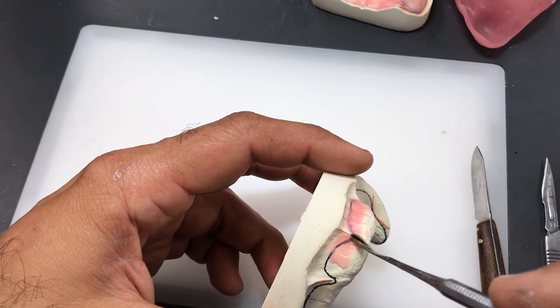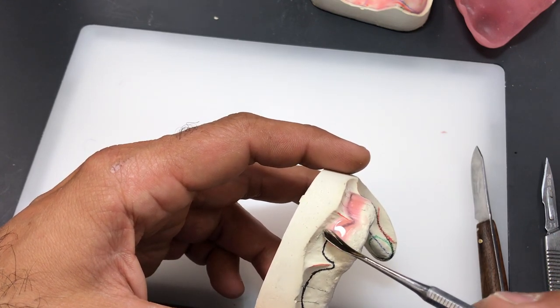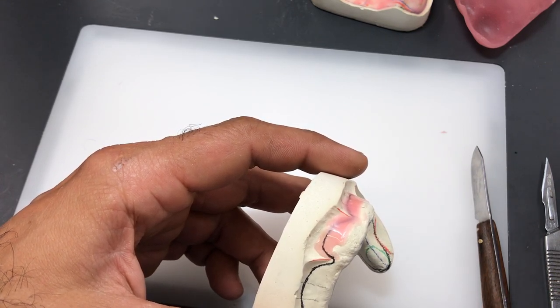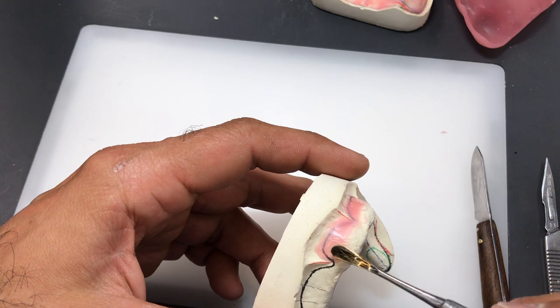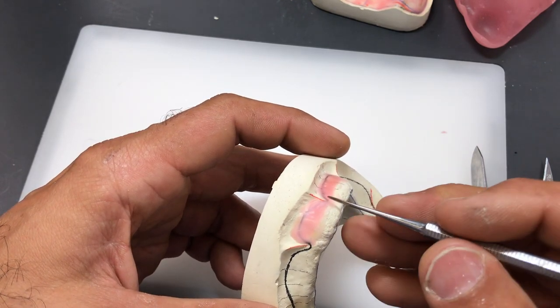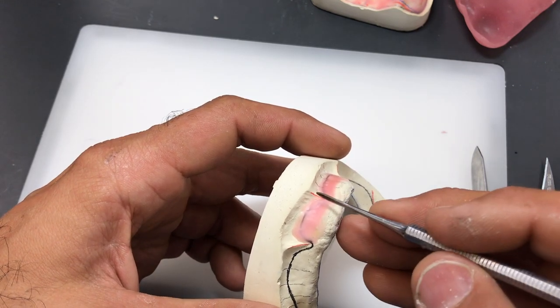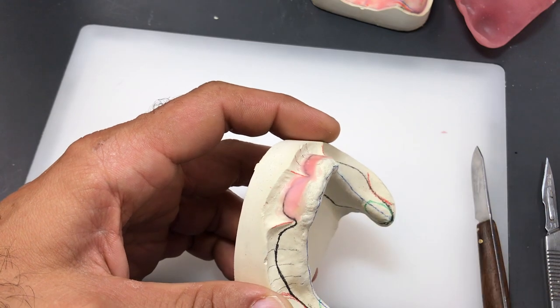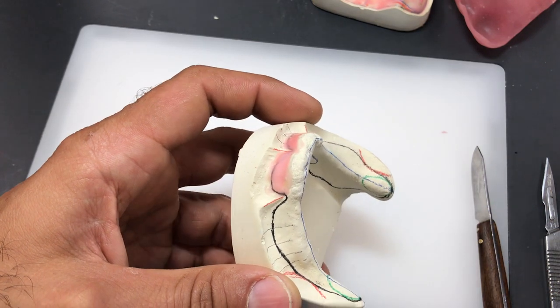And once again, rotate your model in a way that you control the flow of the wax as you're heating it and applying it so it doesn't run all over the place. Heat up your instrument a little bit and go back and carve some of the excess. Very simple.